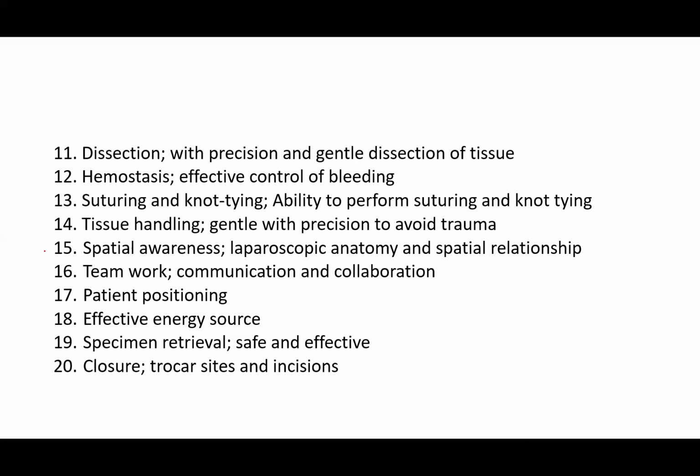Then specimen retrieval should be safe and very effective, especially if you are dealing with an infected specimen or a specimen with suspected malignancy. They should be collected in retrieval bags so that they don't seed the tract when you are removing them through the port site incision.